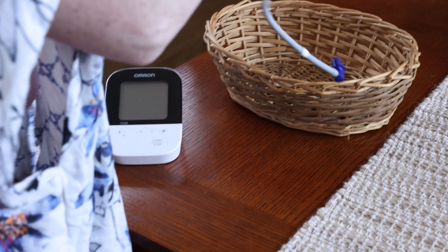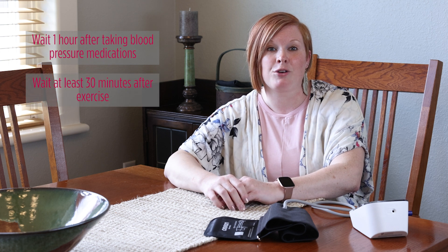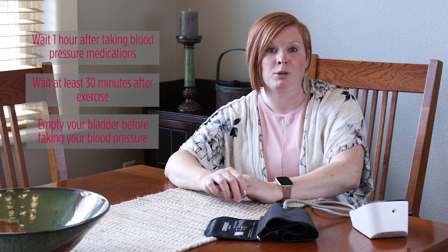First, it is important to follow these guidelines before taking blood pressure. Wait at least one hour after taking any blood pressure medications. Wait at least 30 minutes after exercising before checking your blood pressure. And also empty your bladder prior to taking your blood pressure.